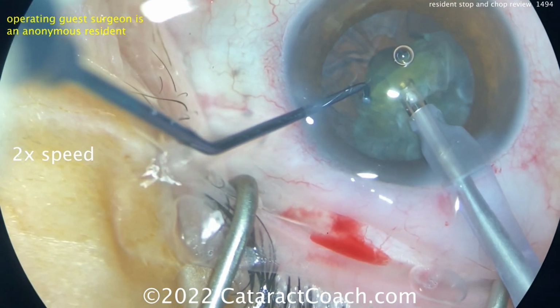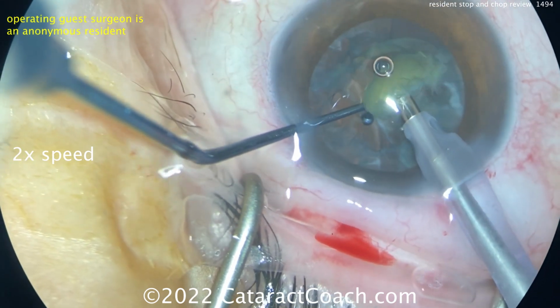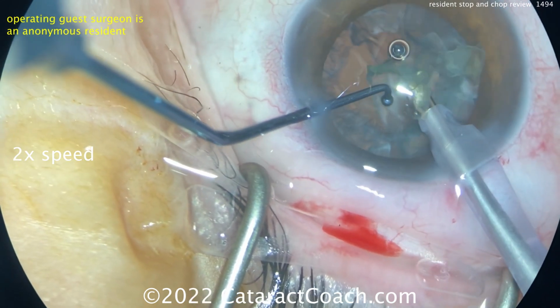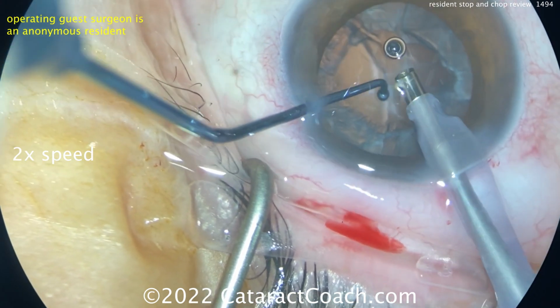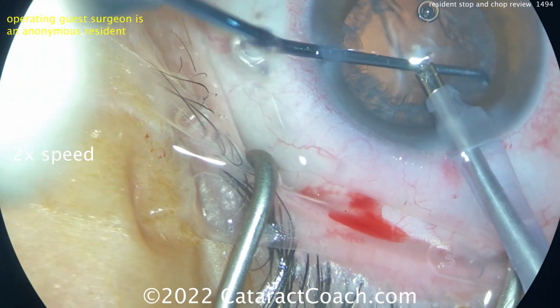And I like how the surgeon's taking his or her time and being very cautious here during this part. Because with a soft lens like this, you may be more likely to nail the capsular bag because you can go through the nuclear piece relatively quickly because the density is so low. And so here at the end, removing most of that lens material, now maybe getting out a little bit of that lens cortex, and then switching over to the IA probe. So definitely something you can do.